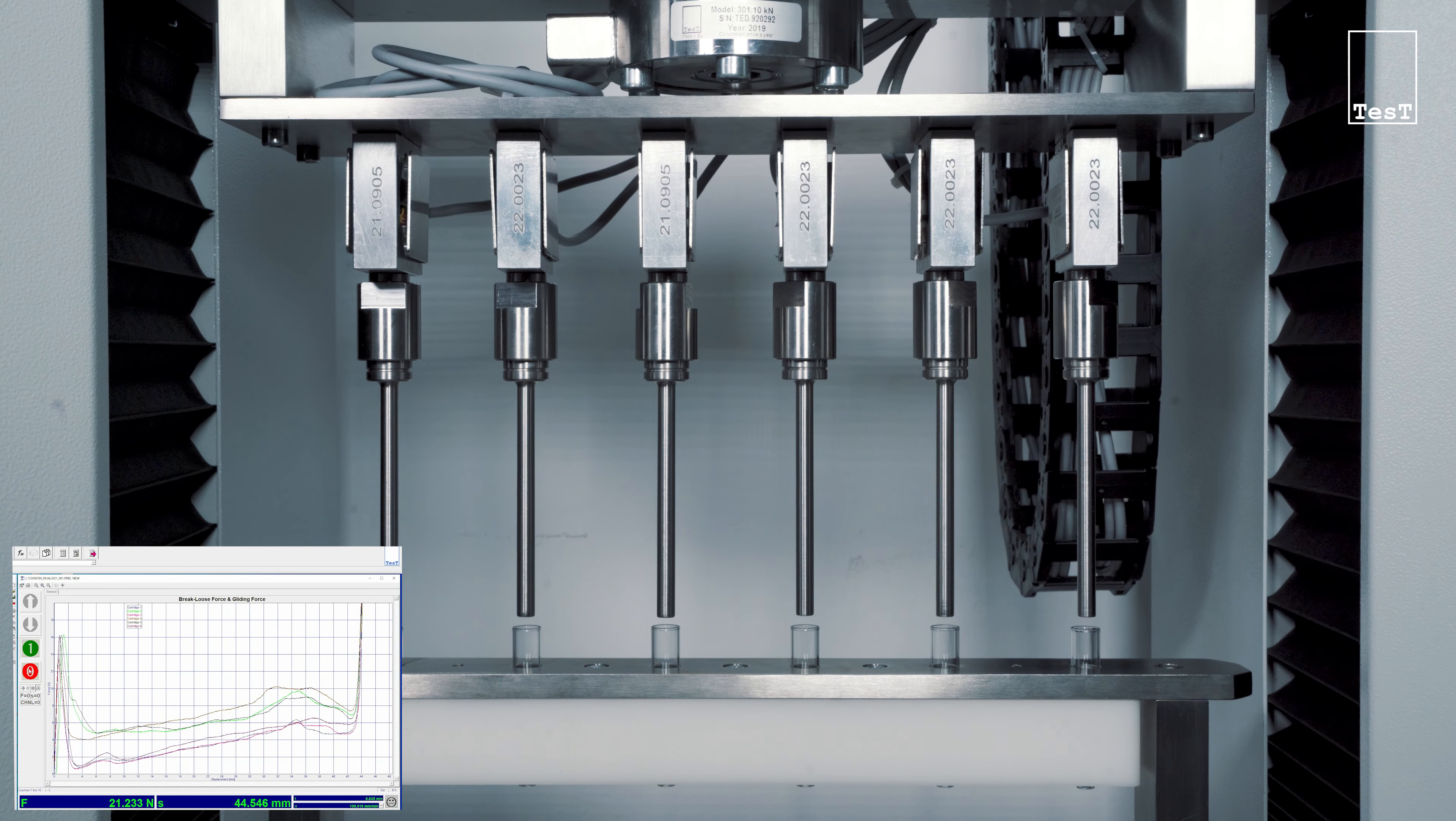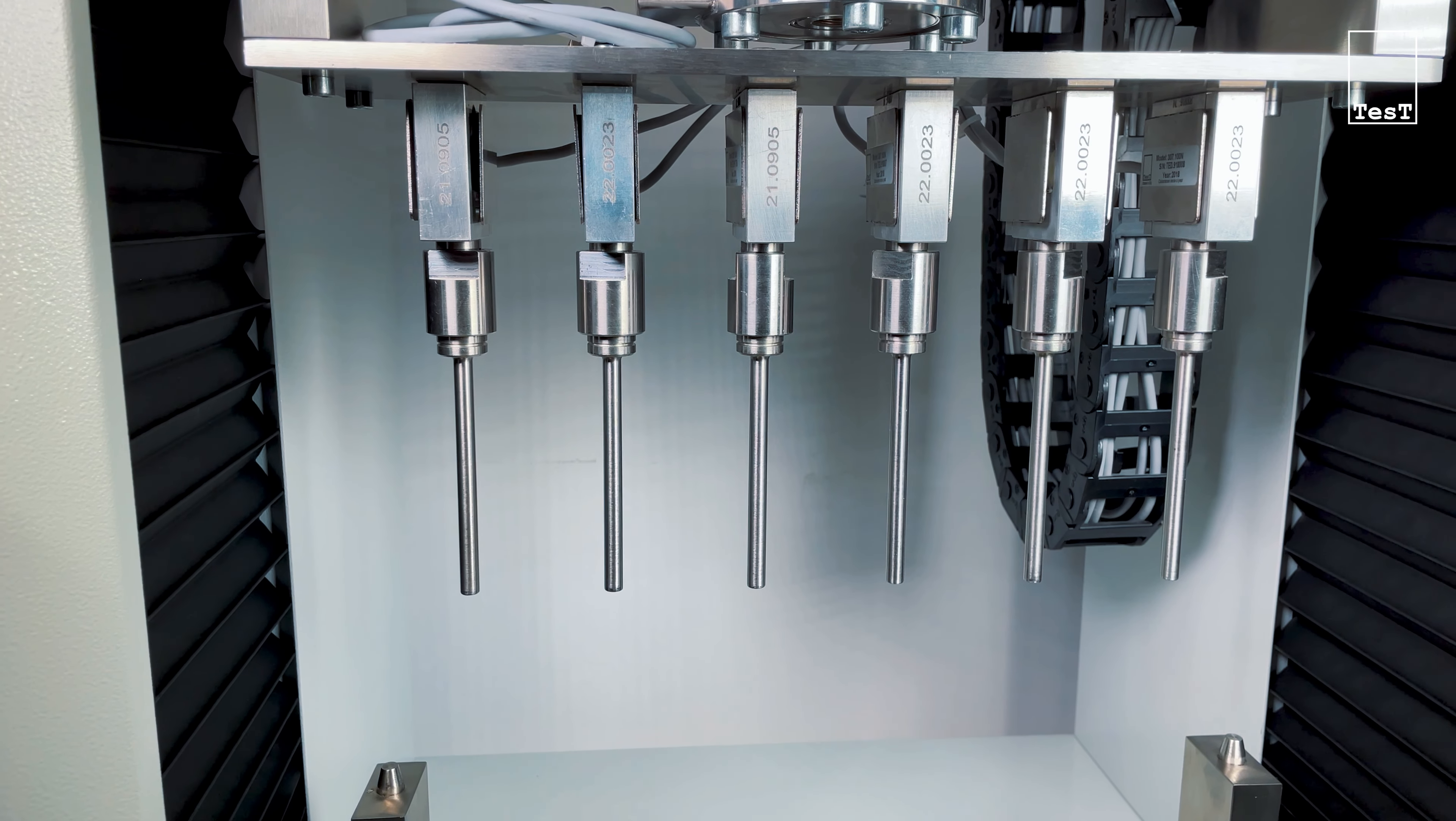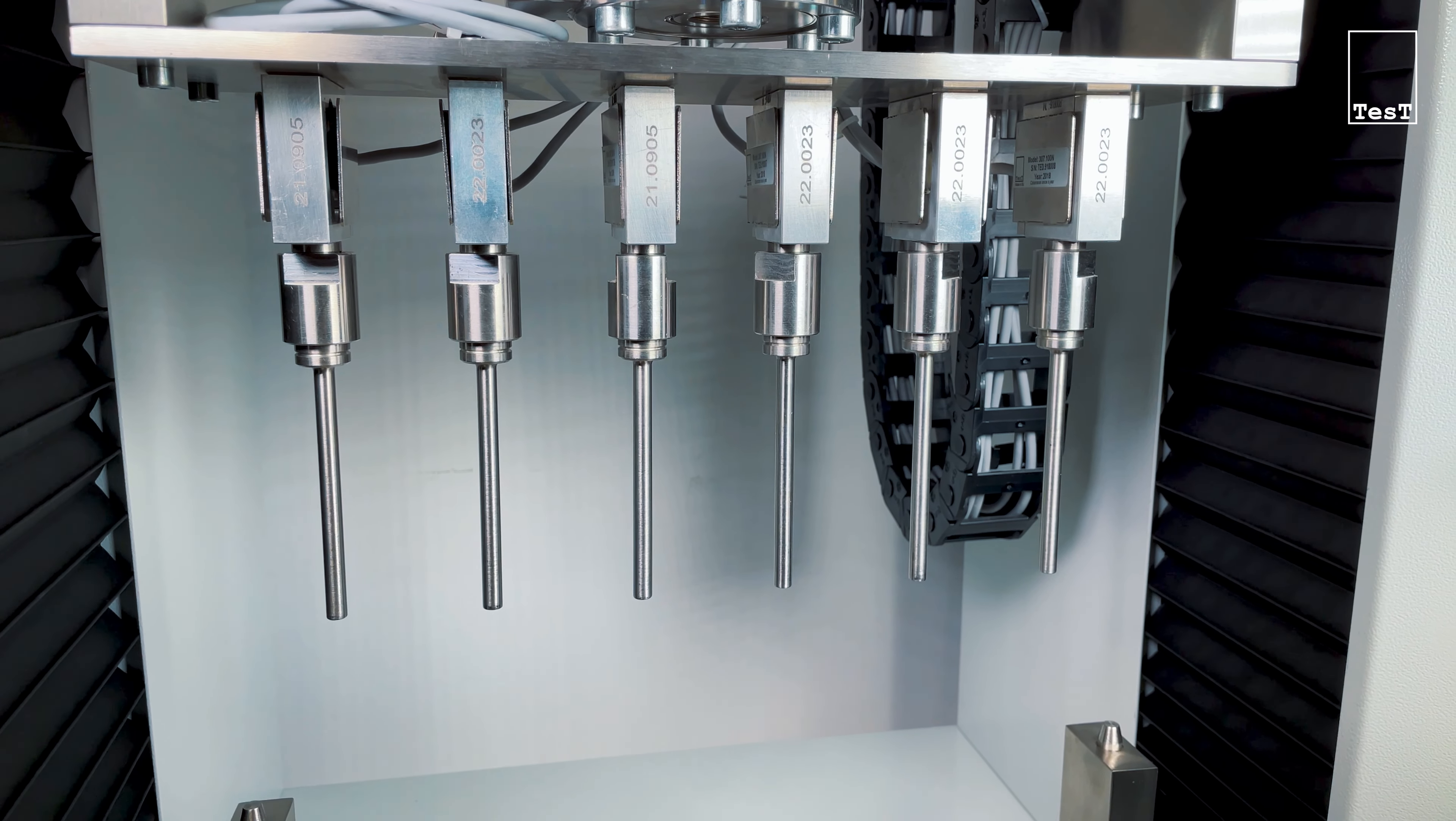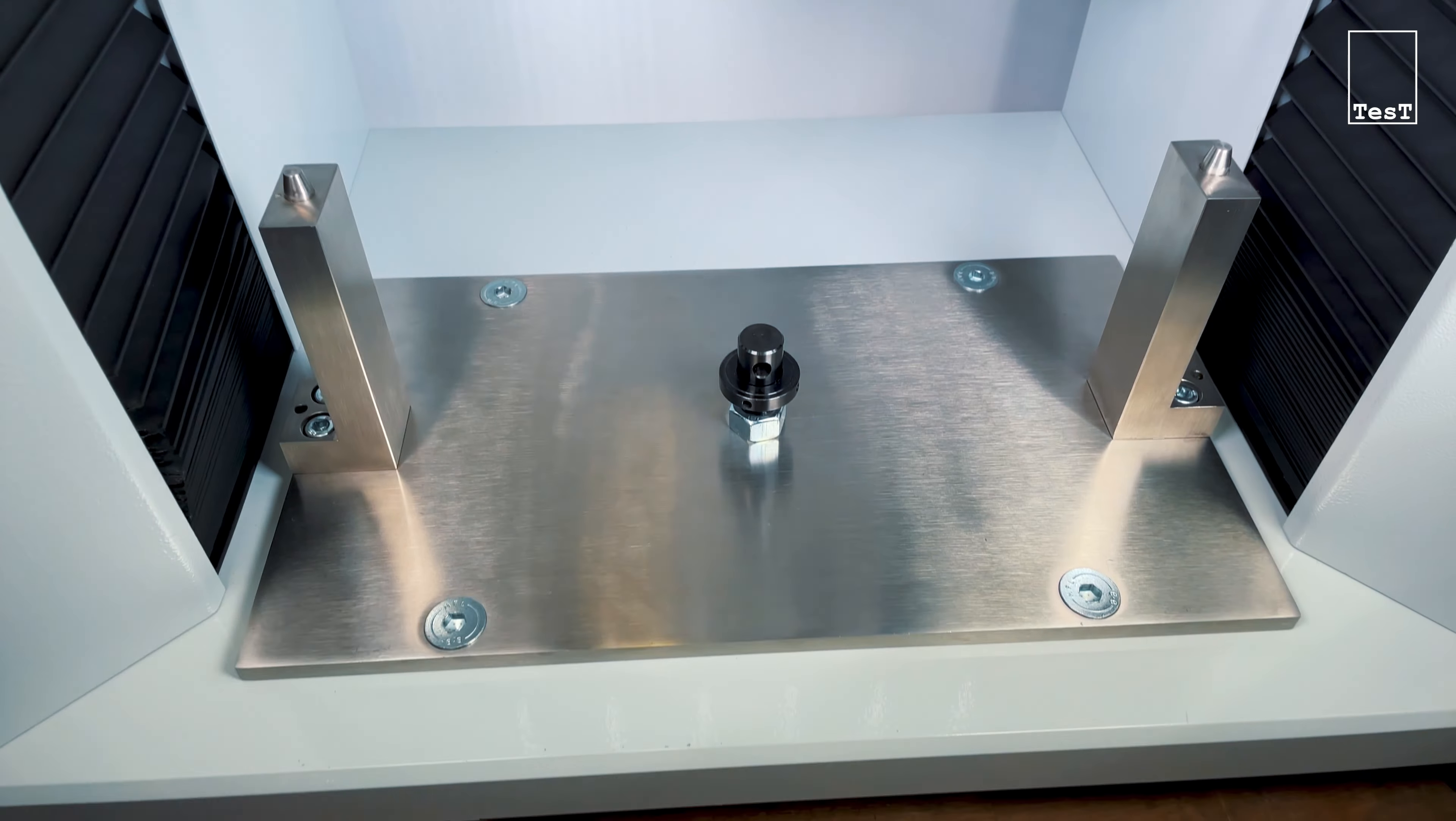The cartridge testing machine is equipped with a stiff load frame, with a high precision linear guiding system, with precision force transducers 307, with an integrated measurement and control system, and an integrated safety system for hazard-free operation.